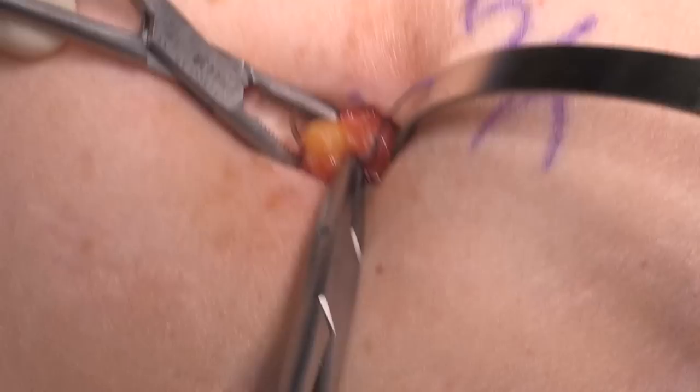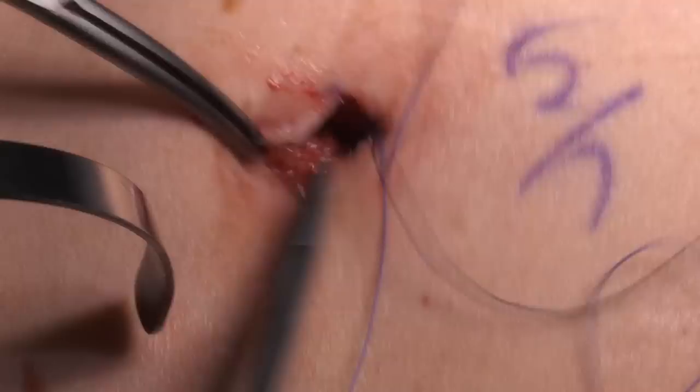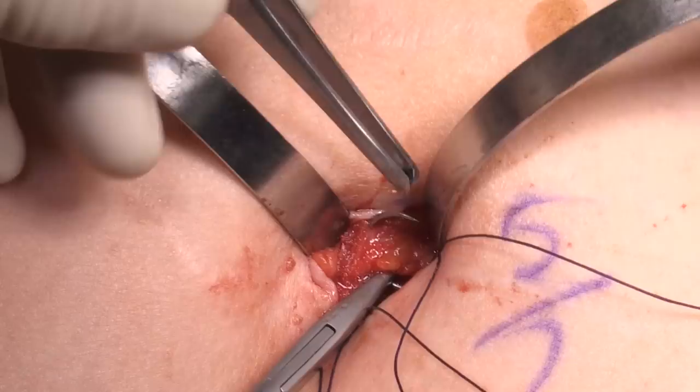We then place retractors on either side of the wound and elevate the fascia in the region, and then we're going to put two anchoring sutures of Vicryl placed transversely at either end of the fascia. These will be used to secure the Hassan cannula in place. I like to take a Kelly type clamp, elevate the fascia so that you decrease the risk of capturing anything intra-abdominal such as the bowel while you're placing these transfascial sutures.